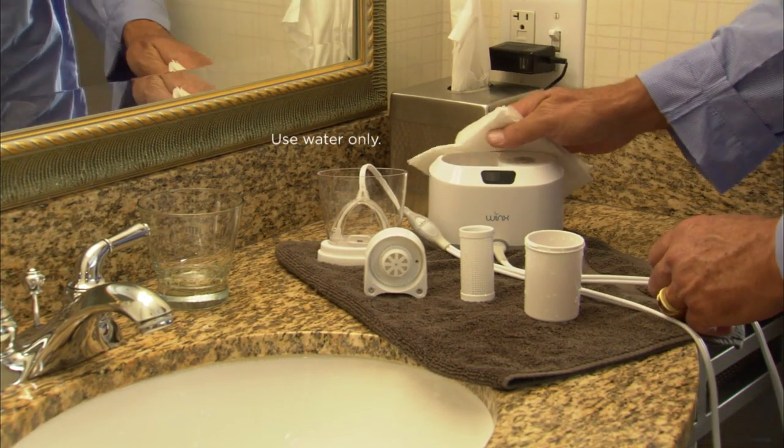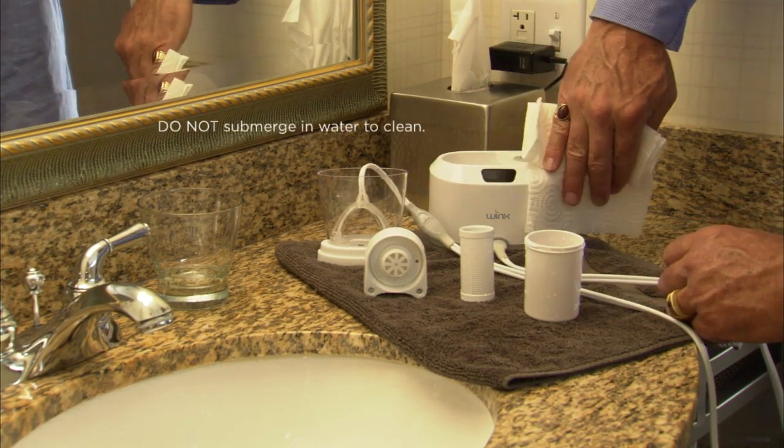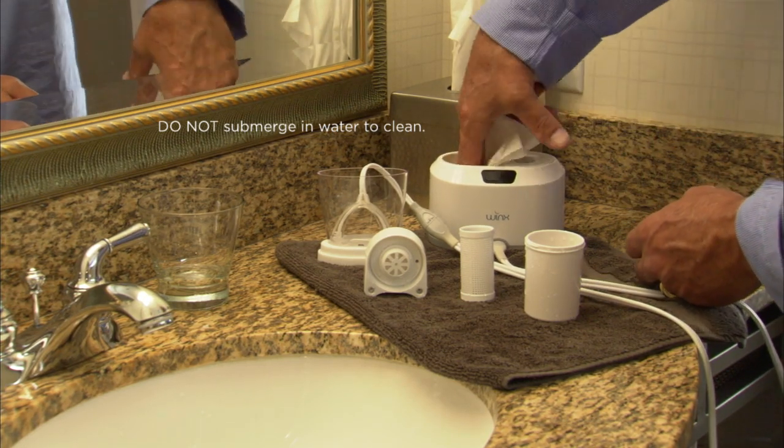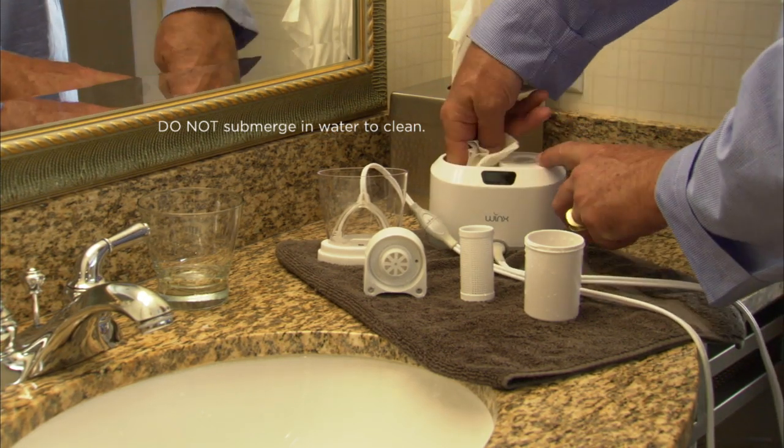Wipe down the console using a damp cloth. Do not submerge in water or use cleaning solutions to clean the console. Avoid allowing water to spill into the reservoir cavity.